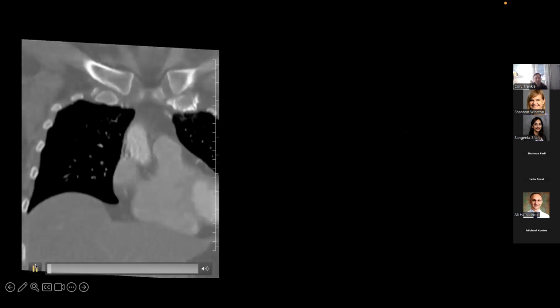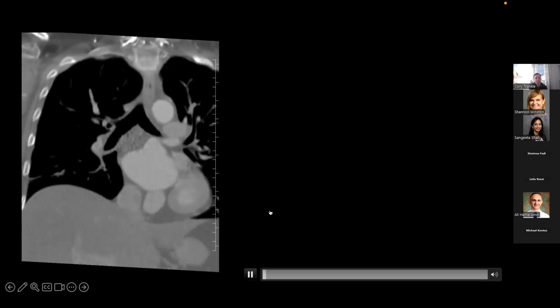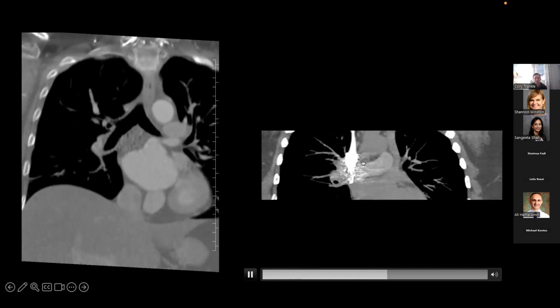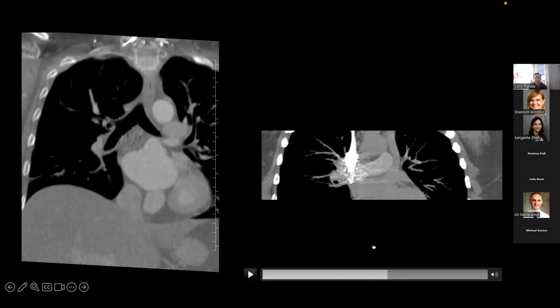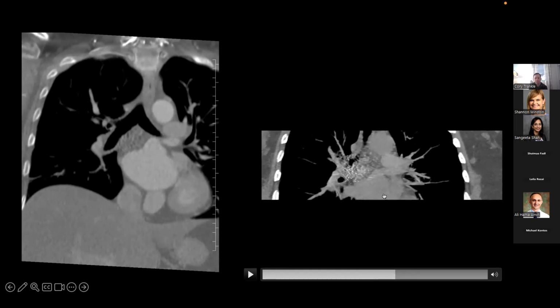And this patient was managed by a covered stent through the lower SVC. And you can see here that the stent is inserted to redirect the contrast, or the flow, from the SVC to the right atrium. When I stop here, you can see the contrast injection is directed mainly toward the right atrium here, not the left atrium, which is here.